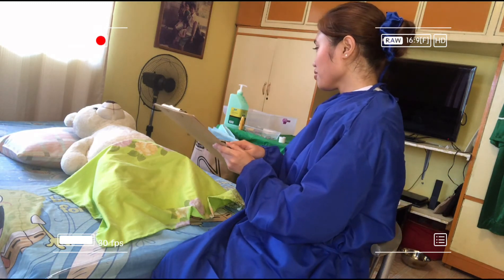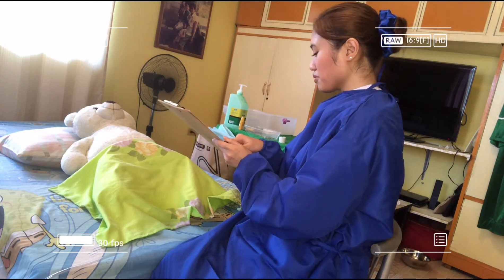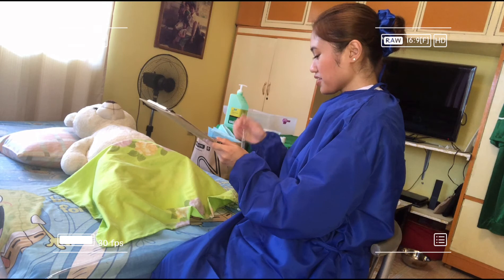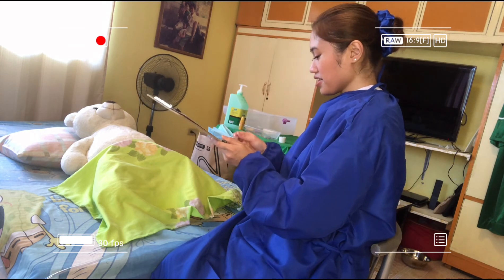I am done inserting the Foley catheter. You can rest now. Thank you for your cooperation. Have a great day.